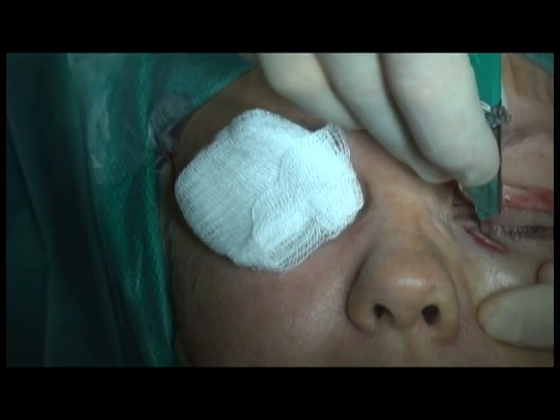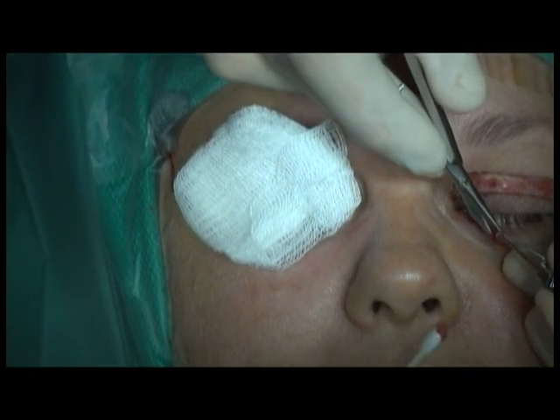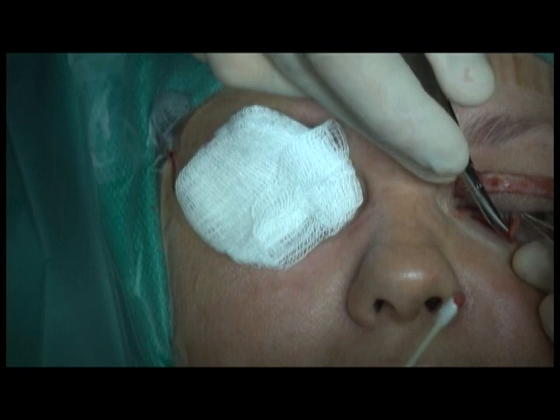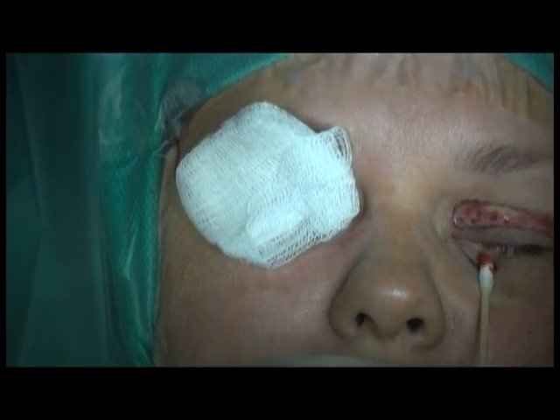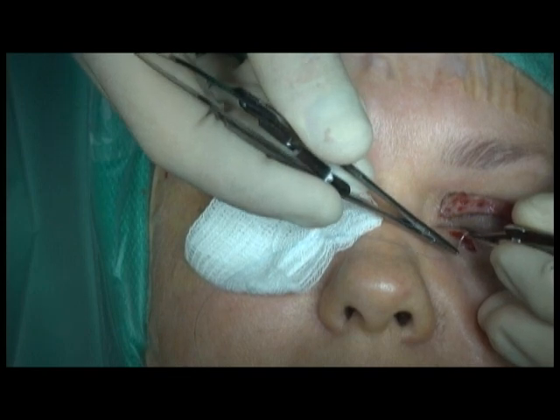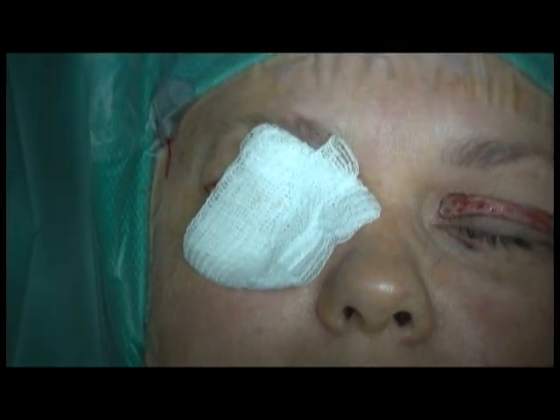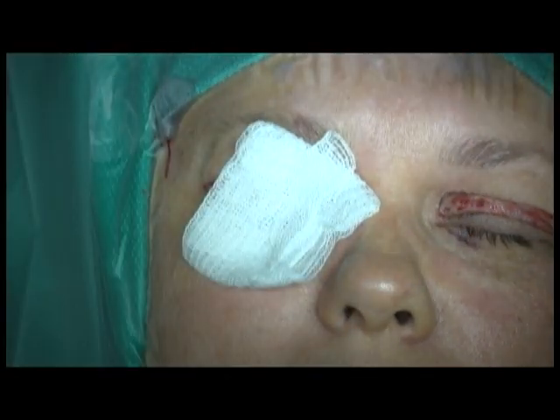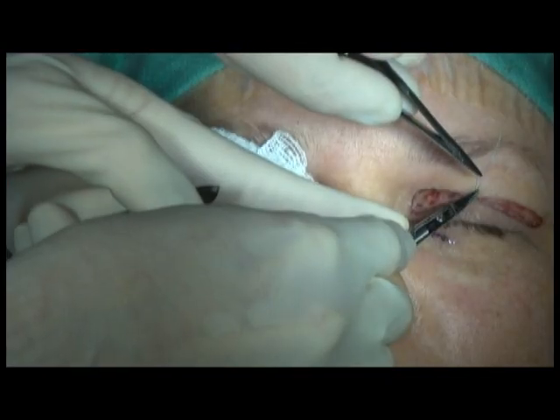The lower lid incisions are then closed with interrupted 6-0 prolene suture. Attention is then directed to the upper lid incisions, which are closed with a combination of running and interrupted 6-0 prolene sutures.